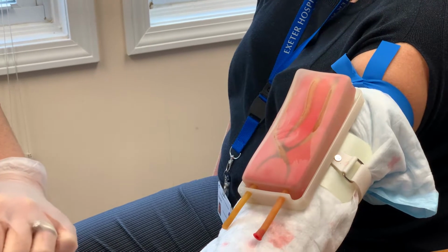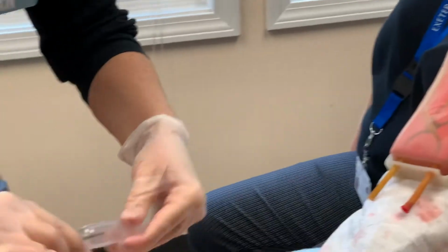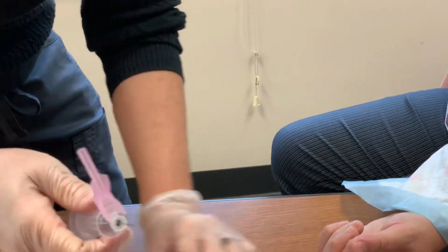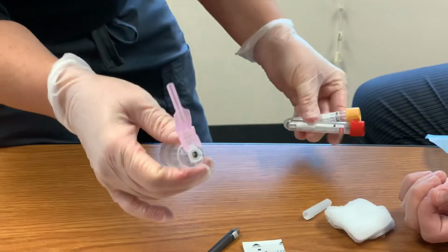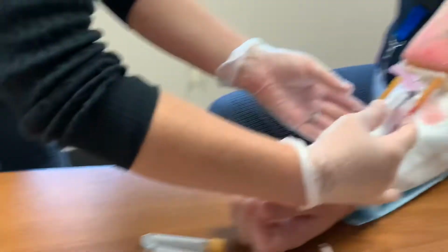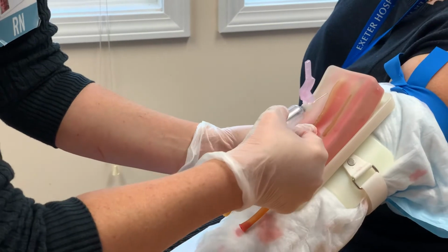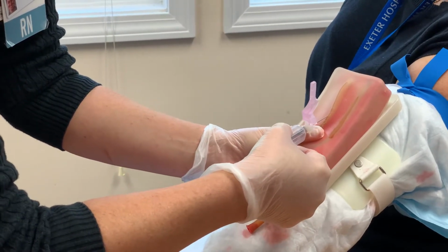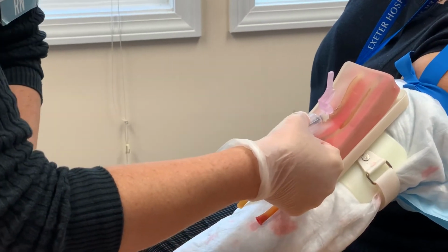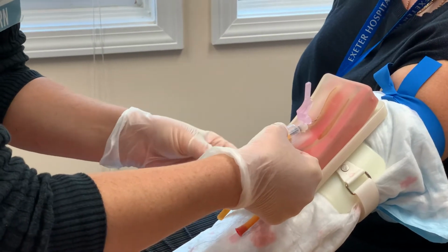I'm going to get my straight needle ready, with the bevel up. These are my tubes I'm drawing today. I've looked at my order of draw. All right. There we go. Okay, so I'm in. I'm going to stabilize my right hand. I'm not moving it because I'm in the vein. I'm getting my blood. You can relax your arm there, Rachel.